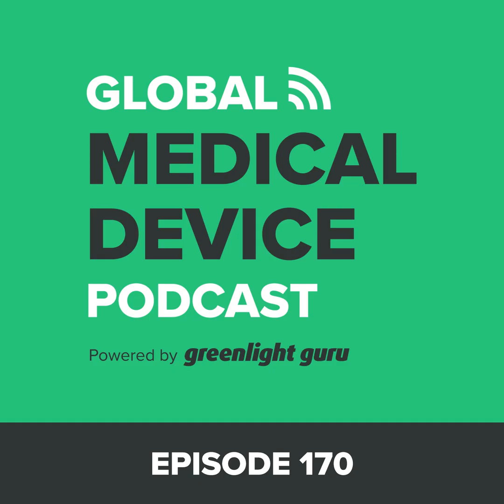And Andrew, in your experience, with the user interface and screenshots, do you think that it's okay to be wireframe, lo-fi, or should these be more high-fidelity types of screenshots? Any opinion on that? They can be wireframe. What FDA is really interested in is what information you are providing to patients and healthcare providers, and then how they are going to use that information. So, do they have the ability to interpret the test results or interpret the information you're giving them? Are you maybe giving them information that's not fully supported by the research? It might be more speculative in nature. So that's why they're really interested in the user interface: how does it tie into your intended use, and making sure you're not overstepping what you're providing to patients and users.